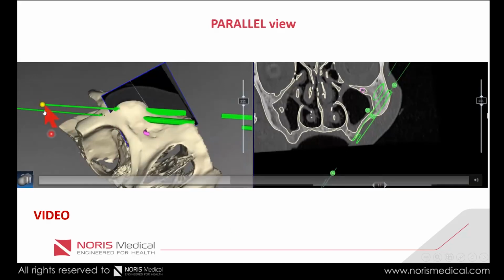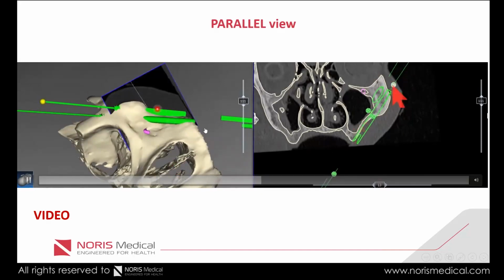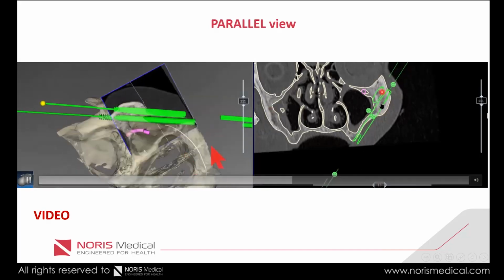Look, if the implant is going down, look that this point has changed. Look what happens if this one is going up and down. You see, this is what's happening. And for each one, we have a different distance when we put our face at the right angle to have the implants parallel, okay? In this case, we see that the distance is very, very short, and it actually is very close to one another, okay?